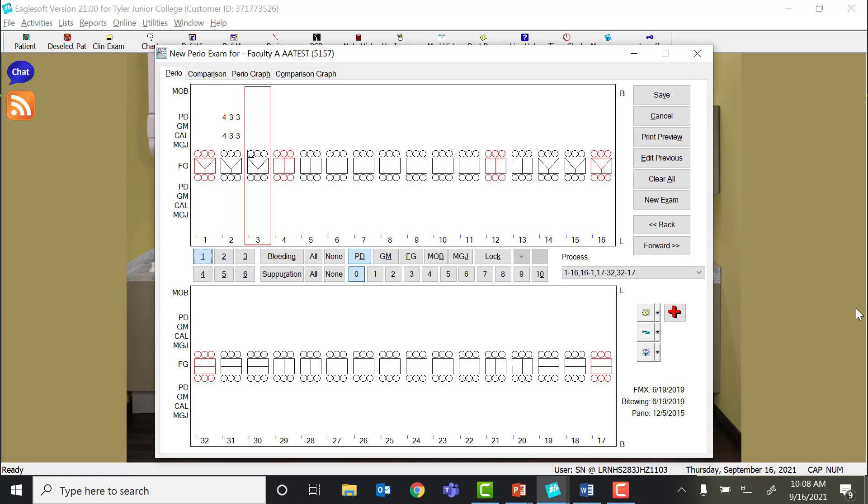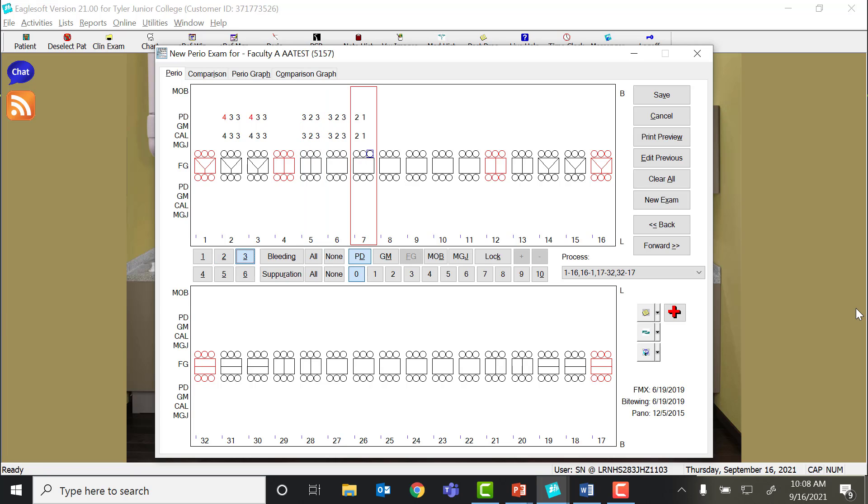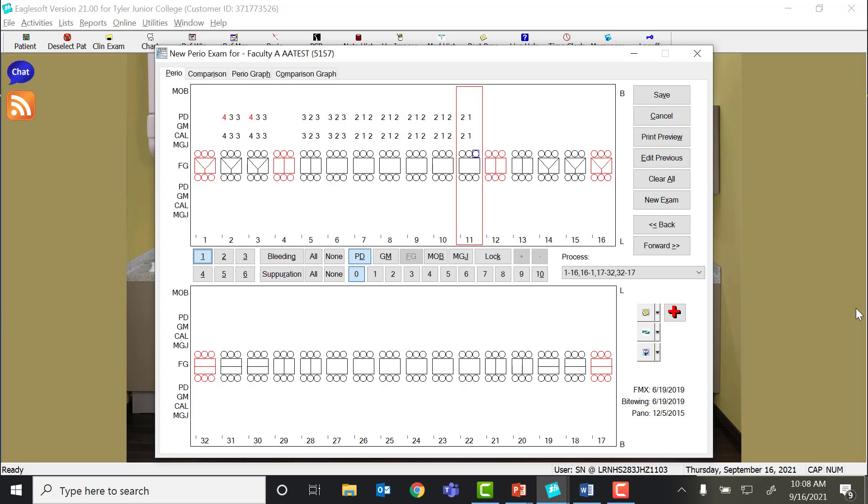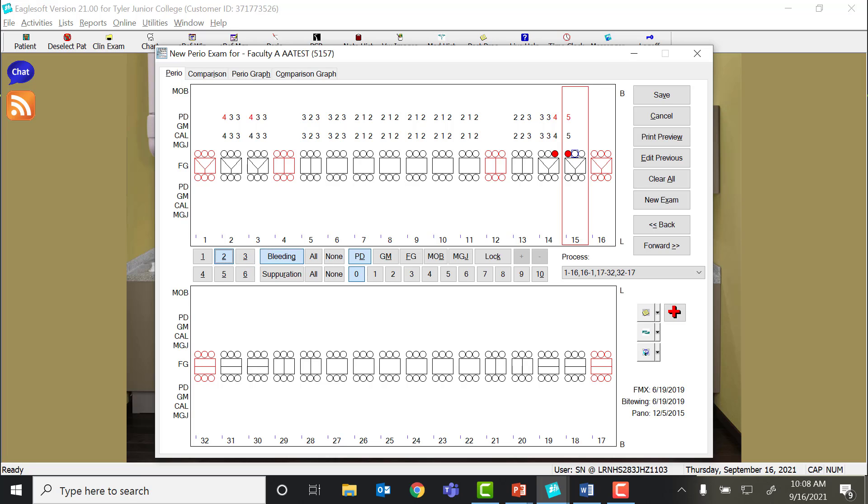Moving towards the midline, we're going to go in the sequence in which Eaglesoft is pre-programmed. Let's say this patient is pretty healthy. We had some bleeding here, bleeding here. And by putting in the bleeding, I'm doing G5, G5, G6. Or I can click the bleeding tab.